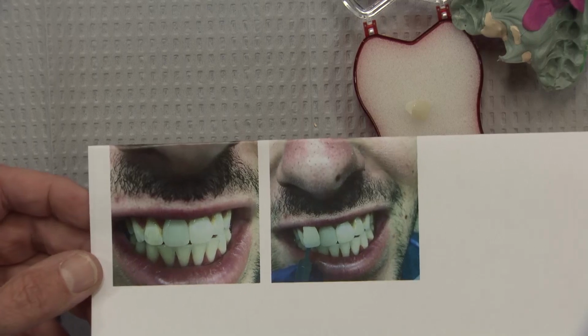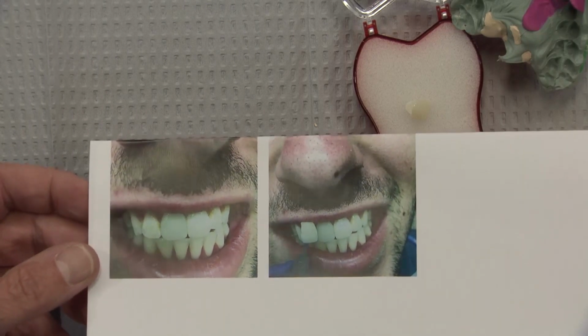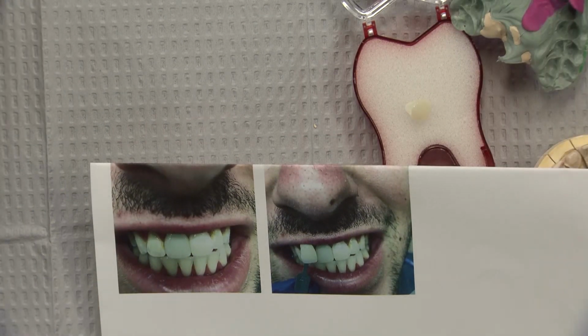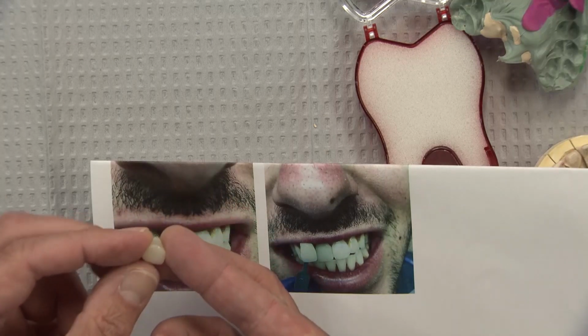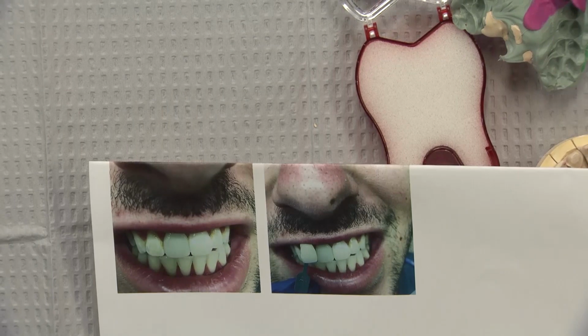The doctor could, if they really wanted a more aesthetic crown such as e.max or anterior BruxZir, have gone in and added some white composite to the front of that preparation and kind of opaqued it and kept it from showing through. But I don't know, that seems a little dicey at times. And yes, we could probably put some internal opaque on the inside of the anterior BruxZir crown. But again, that's a little dicey too. And probably the safer thing is to use a less translucent material.